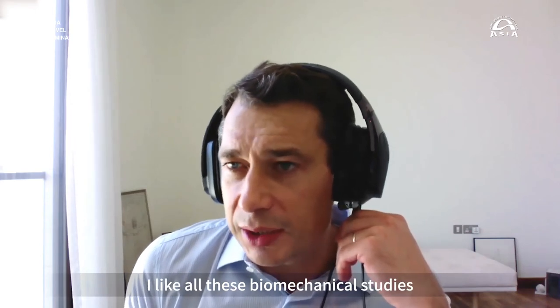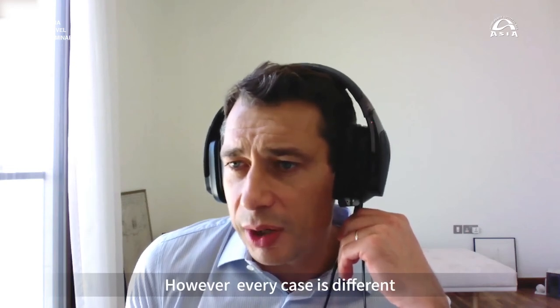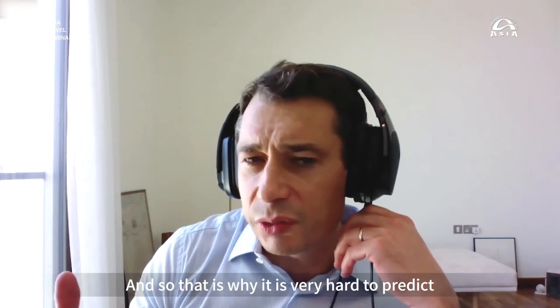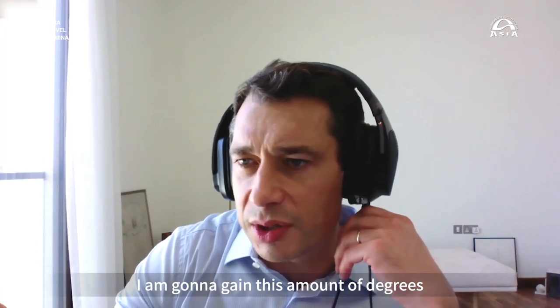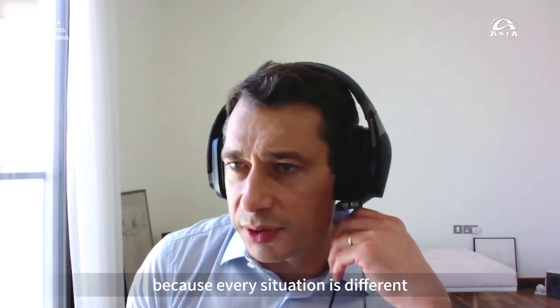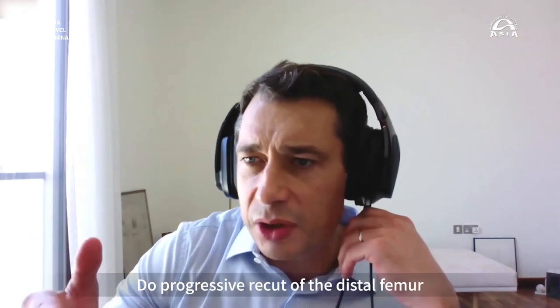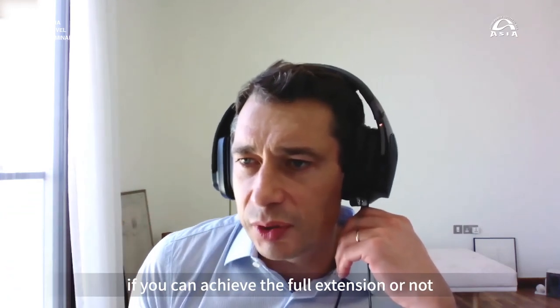I like all these biomechanical studies that you presented. They are great, giving us good indication. However, every case is different, because there's osteophyte, there's different soft tissue adhesion, so it's very hard to predict that if I cut 2 millimeters I'm going to gain this amount of degrees. So to summarize, never go up to the insertion of the medial collateral ligament. Do progressive recut of the distal femur, and see with your spacer block if you can achieve full extension or not.